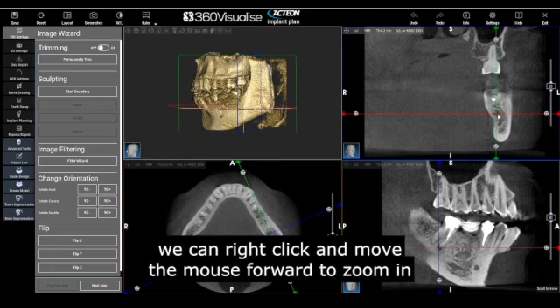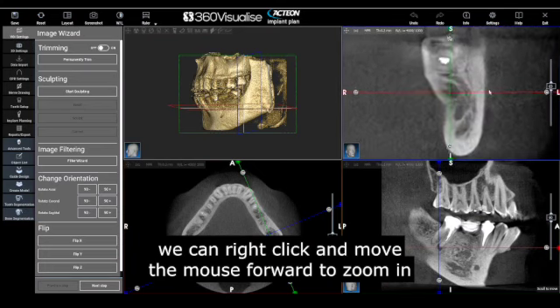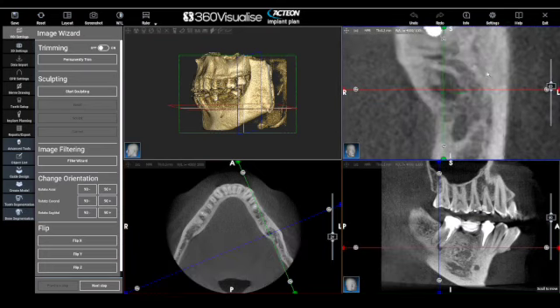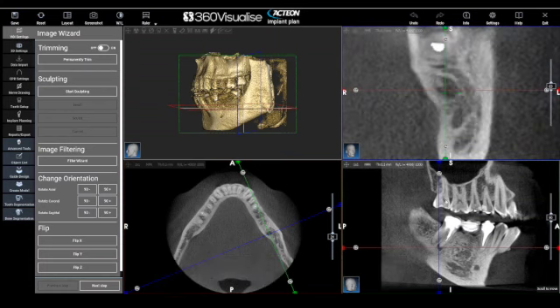We can right click and move the mouse forwards to zoom in and backwards to zoom out.